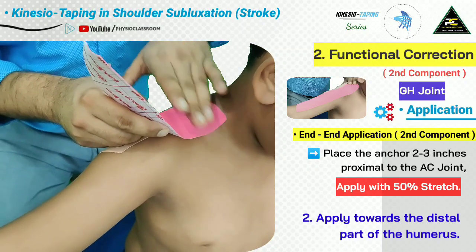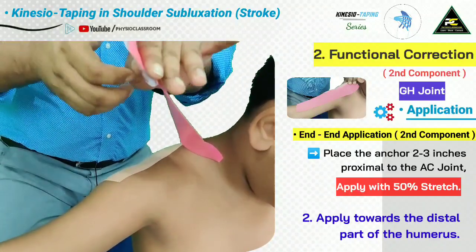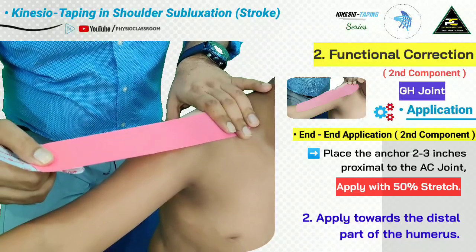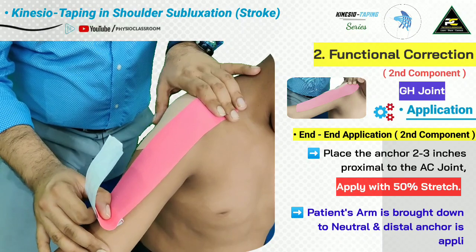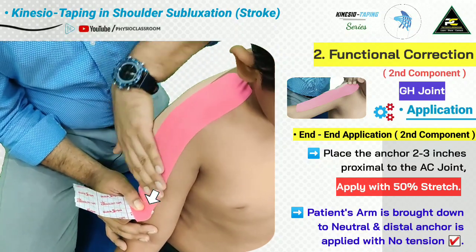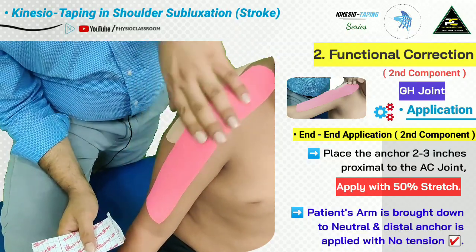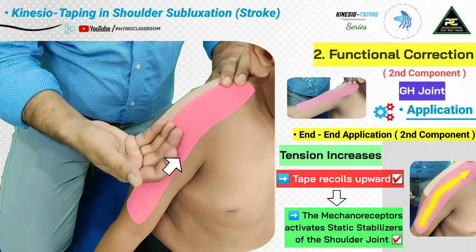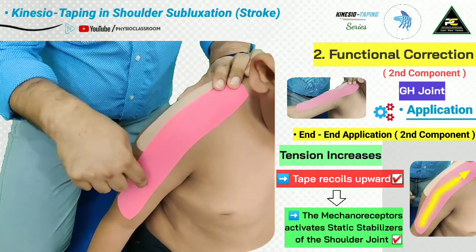Rub the anchor properly, then remove the paper backing, leaving some for the distal anchor. While stabilizing the proximal anchor, stretch the tape to around 50 percent tension and place it over the distal part of the humerus. Ask the patient to lower the arm, then slide the hand downward, applying friction, with the last part of the tape applied with no tension. Because there was 50 percent tension with the arm abducted, as the arm comes down the tension increases further, and the recoiling effect of the tape in the superior direction activates mechanoreceptors in the skin, helping activate muscles that counteract the inferior pull of gravity.